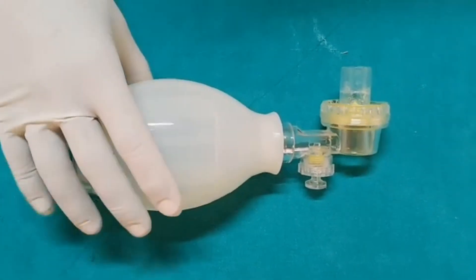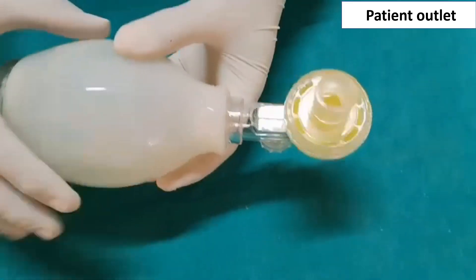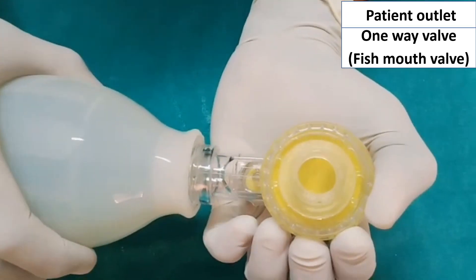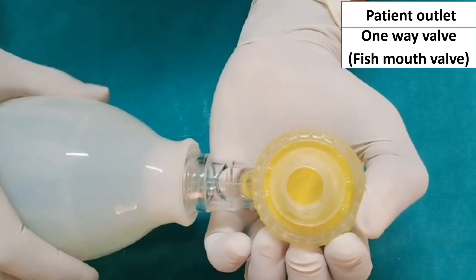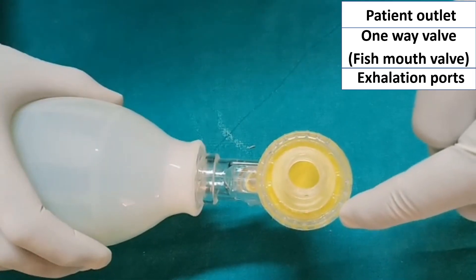Now I am showing you the parts of the Ambu bag, or self-inflating bag. This is the patient outlet. Now see the fish mouth valve — this is a one-way valve. These are the exhalation ports.